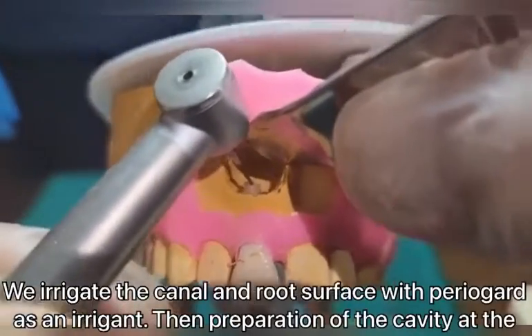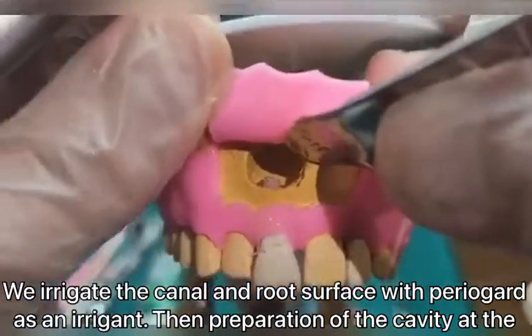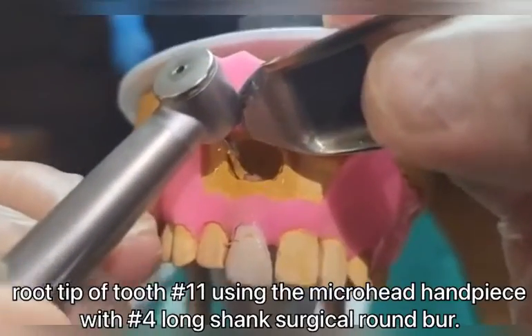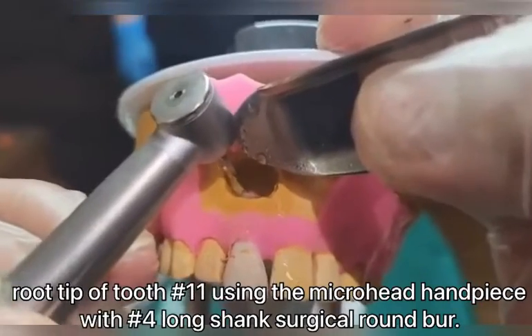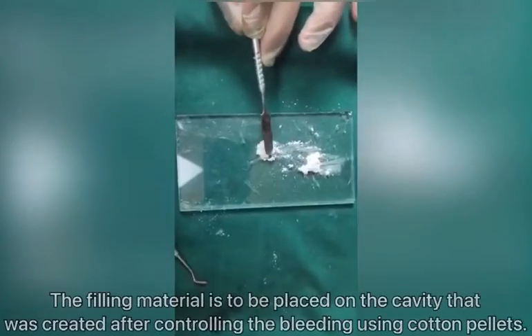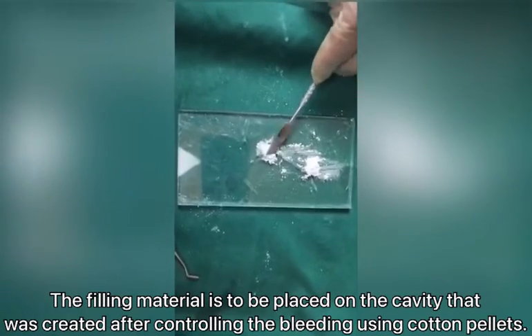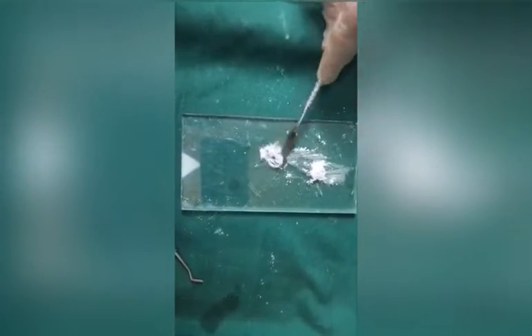We irrigate the canal and root surface with Perigard as an irrigant, then preparation of the cavity at the root tip of tooth number 11 using the microhead handpiece with number 4 long shank surgical round burr. The filling material is to be placed on the cavity that was created after controlling the bleeding using cotton pellets.